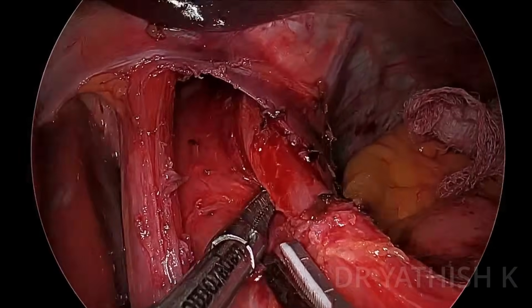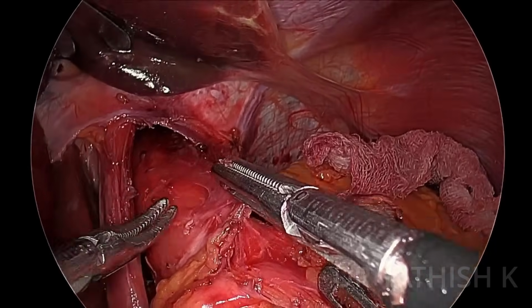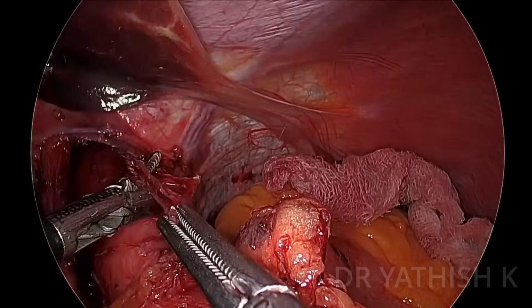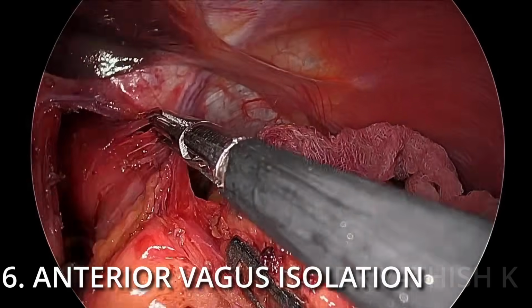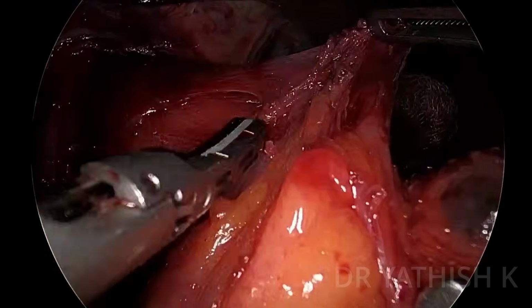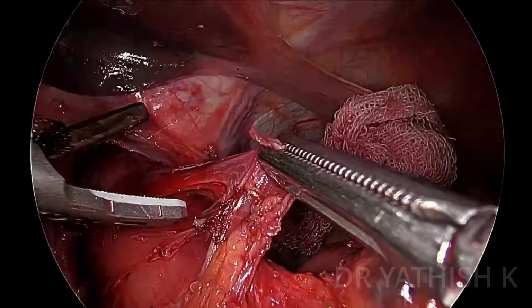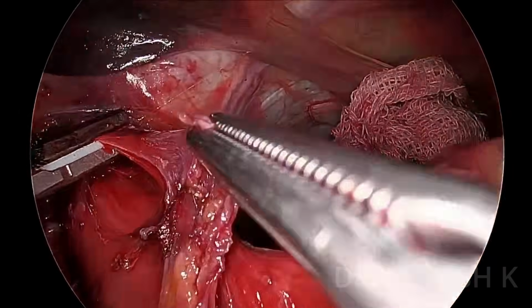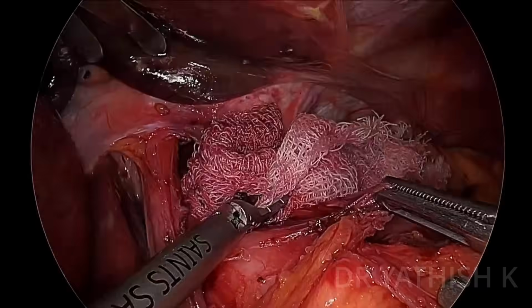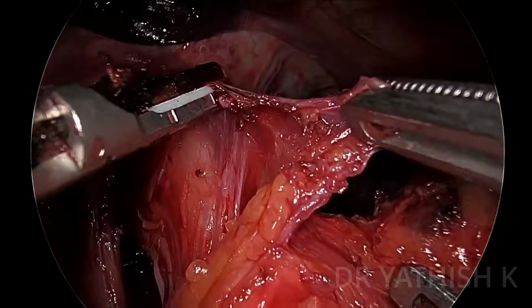So now that I've identified the anterior vagus, I'm just going to salvage it by lateralizing the nerve. Why do you have to do this? Because the nerve runs anteriorly, which will be close to your myotomy site. So you want to make sure that you safeguard the nerve. This procedure requires careful dissection, good anatomical orientation of the structures, and meticulous preservation of the nerves. Once you achieve that, you'll have a successful procedure.